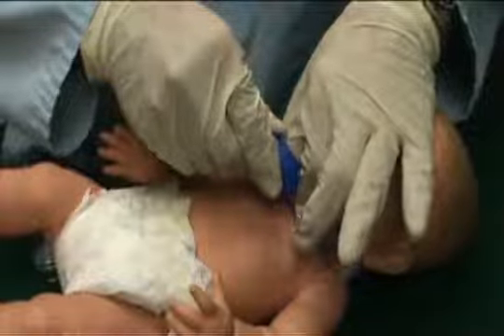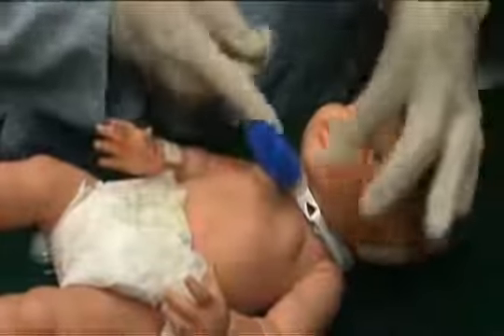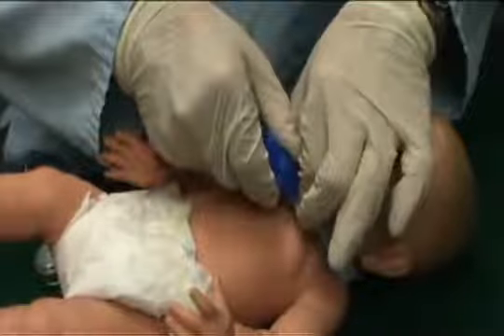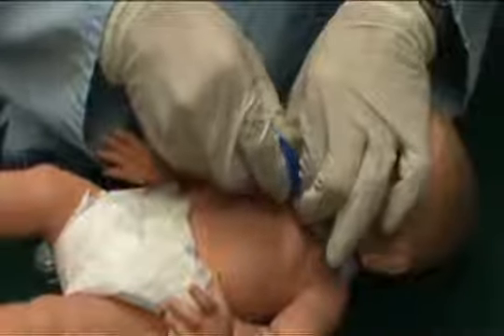a quarter turn. To remove the accessory, you must again ensure that you're wearing non-sterile gloves. While firmly holding the base of the connector with one hand, use your other hand to gently rotate the accessory while pulling up, which loosens the seal.